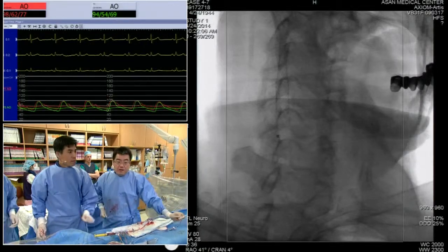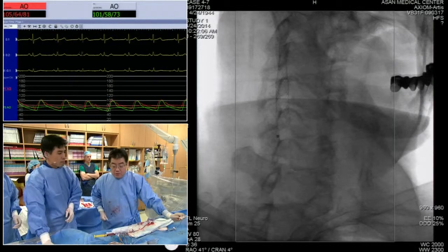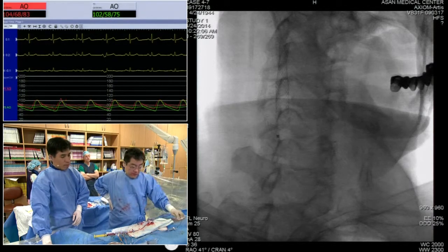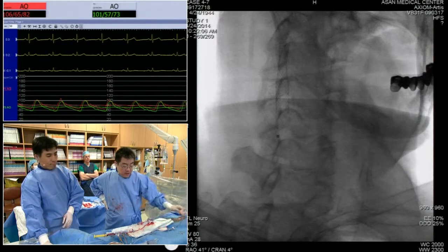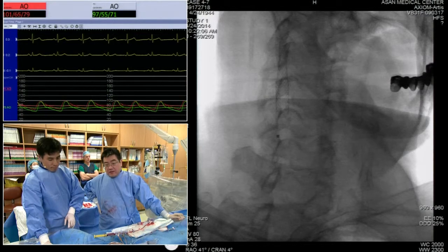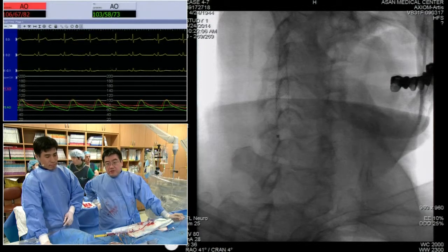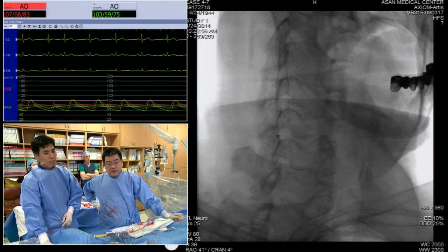If before the actual treatment we did find some distal intracranial aneurysm, we will size the aneurysm. If it's larger than 5 millimeters, then of course we will have the neurointerventionist coil it first if they want to. Or we can do this in a simultaneous session, where we stent the carotid first and then the neurointerventionists come in and do the intracranial coiling at the same stage, because sometimes the carotid stenosis is just too tight for them to do intracranial coiling.